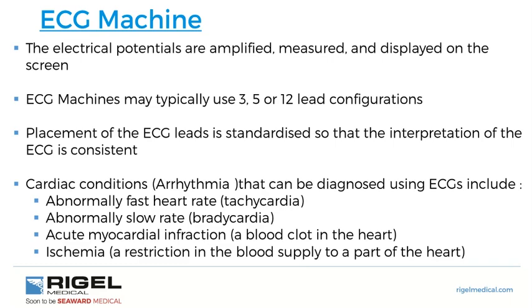And some ECG monitors and patient monitors can diagnose or confirm cardiac conditions, which is arrhythmia like tachycardia, bradycardia, and myocardial infarction and ischemic conditions.